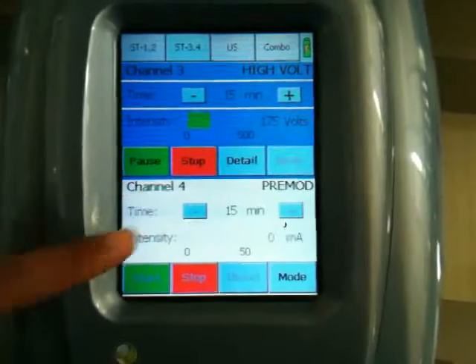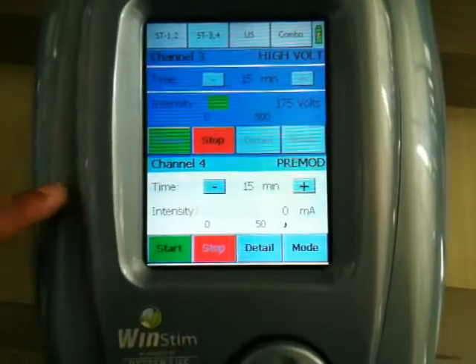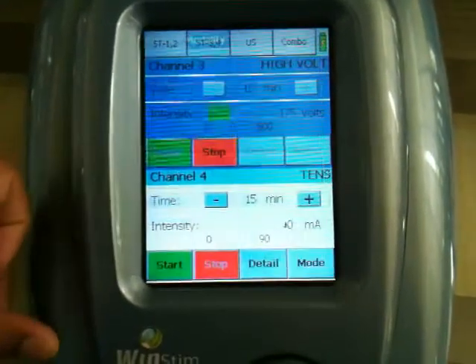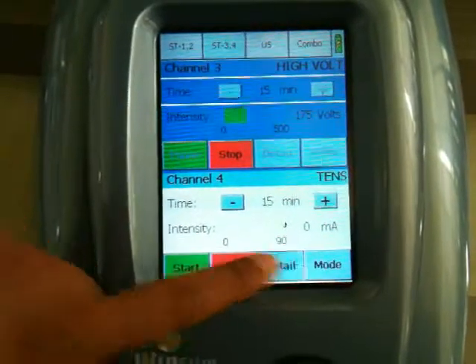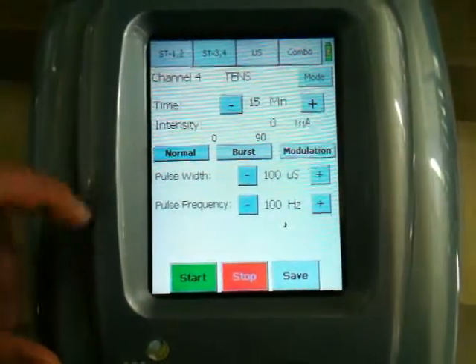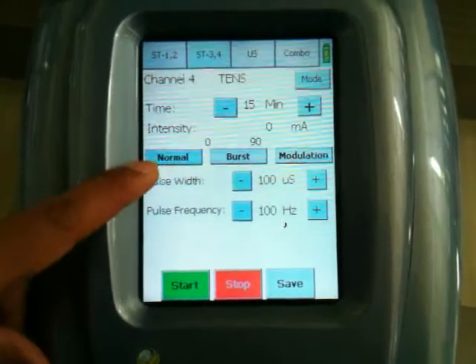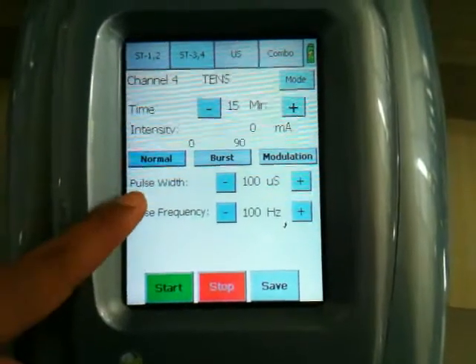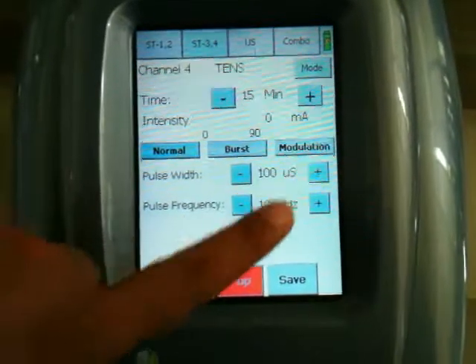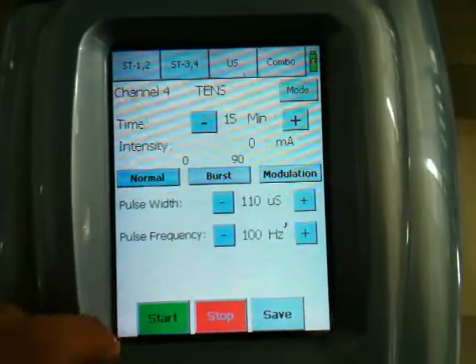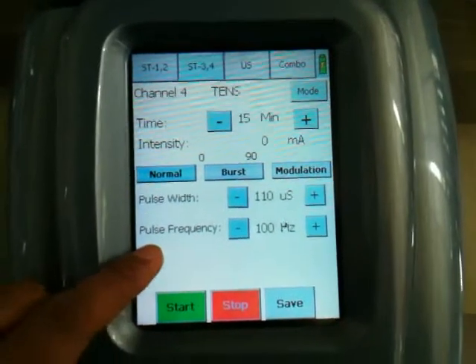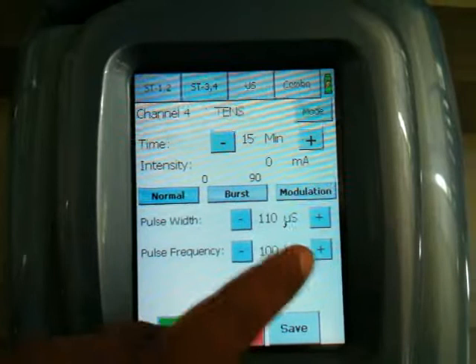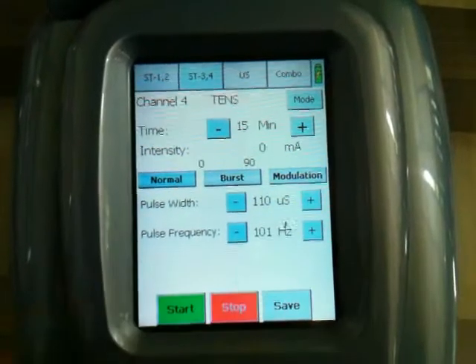Now let's move to channel number 4. We can select the mode — let's take TENS this time. We can go through the detail settings. We can select the parameter, the timer, and the type of modulation: normal, burst, and modulation. Pulse width can be customized by plus and minus in steps of 10 microseconds. Frequency can be set in steps of 1 Hz.